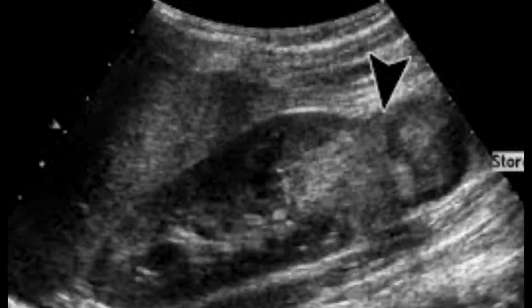nephroblastoma. As in the previous images, you have seen that this Wilms tumor and nephroblastoma involves the middle pole and interpolar junction, which was confined to the renal parenchyma. But in this case, you can see that this Wilms tumor is protruding out of the renal parenchyma. I would say here that it is breaching the renal capsule, however still remains spherical, and it is heterogeneous in nature. Being small in size, you cannot easily appreciate the hemorrhagic or the central necrotic changes, but that was the case where this is breaching the renal capsule.